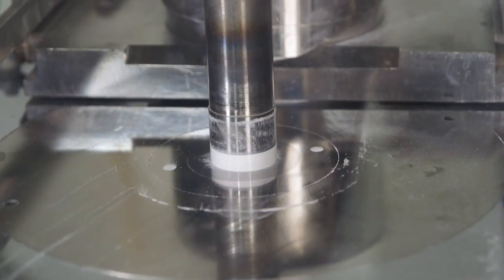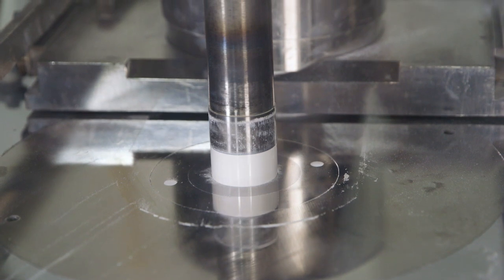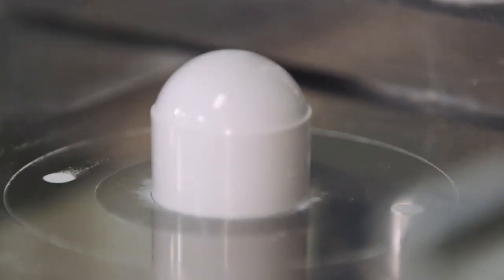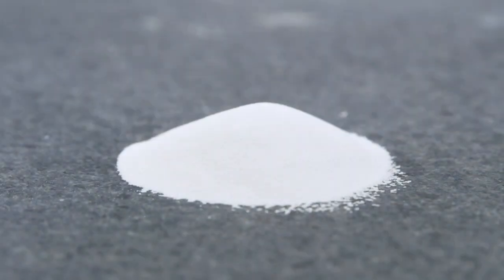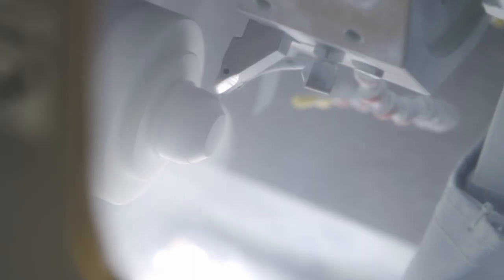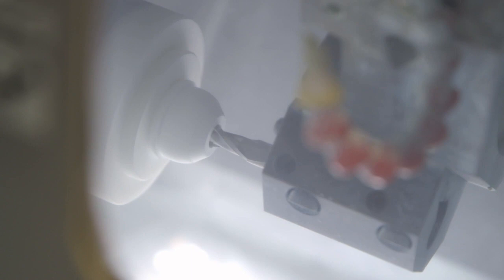After the initial pressing, the part has a smooth finish and is the consistency of chalk. Next, the pressed part heads to a CNC lathe. The lathe creates the general shape of the femoral head.